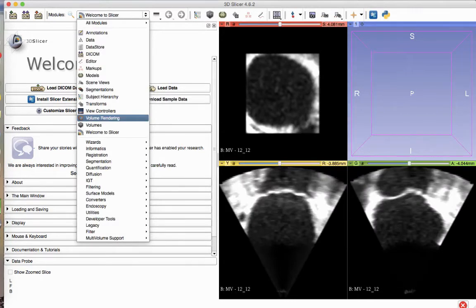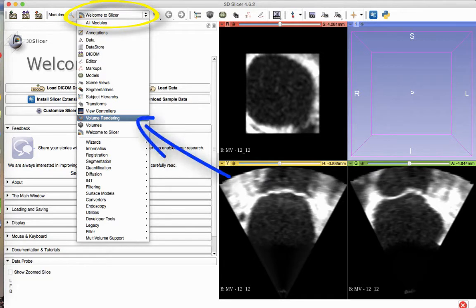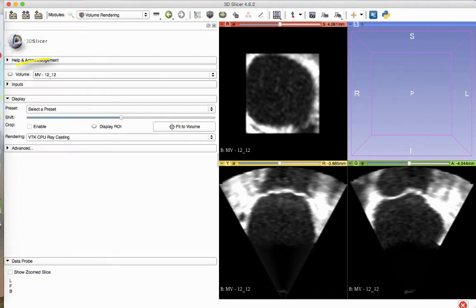Now that the dataset is loaded, from the Modules drop-down menu, select the Volume Rendering module. The active volume will be the name of the file that you selected.